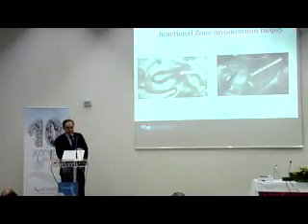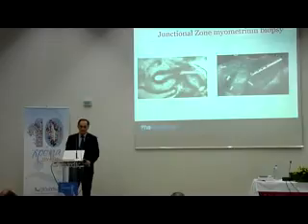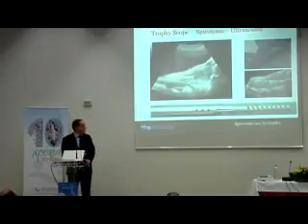Here we are back again, MRI. Now here you see in ultrasound that this white zone is something peculiar. So we need a biopsy there. How will we do it? We can ask the professor to do a laparoscopy, but then he will take the whole womb. It's not what we want. We want to do the job atraumatically, without anesthesia, without pain.